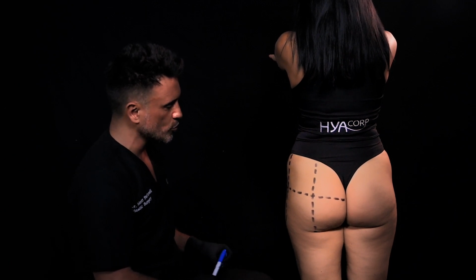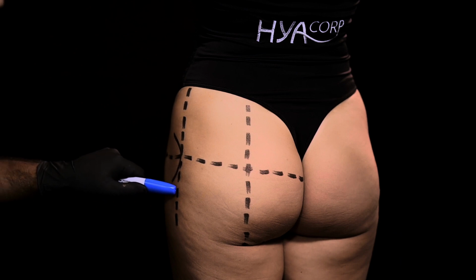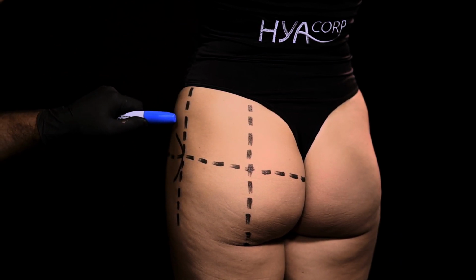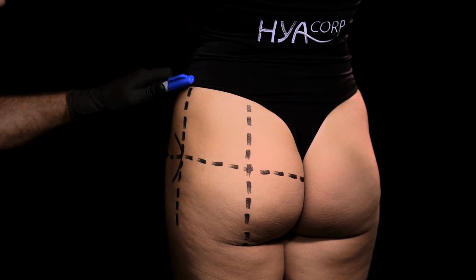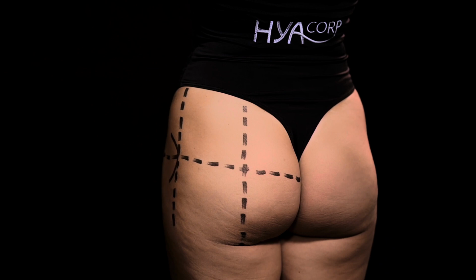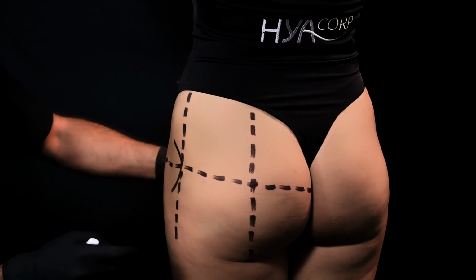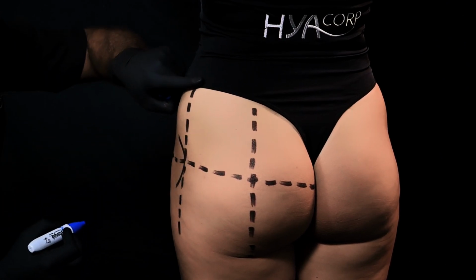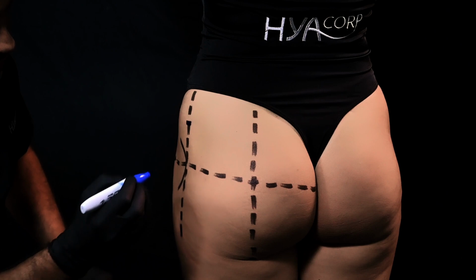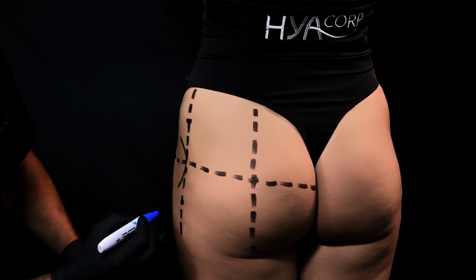So now I'm going to use the blue marker for the injection zone. Actually, what we want to do, we want to go from this point to this point. We want to bridge over these two points to be able to fill this depression and to have a homogeneous and single contour on the hips. I'm going to mark this zone. We see here that it starts to deepen at this level, so it will be one. At this level also in the lower part.